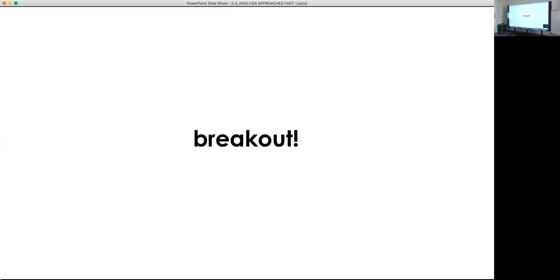Yeah, and another general idea out there, and I'm just parroting, typically you want to smooth to the scale that you think exists. Like we try to measure activity patterns, right? You do fMRI, you get complicated activity patterns, and maybe you're interested in contrasting two, so A minus B. That is a spatial map of something. Like it's in volume, it's on the surface, whatever. And that has a spatial scale. Like it's either a really low frequency thing, or it's a really punctate thing.